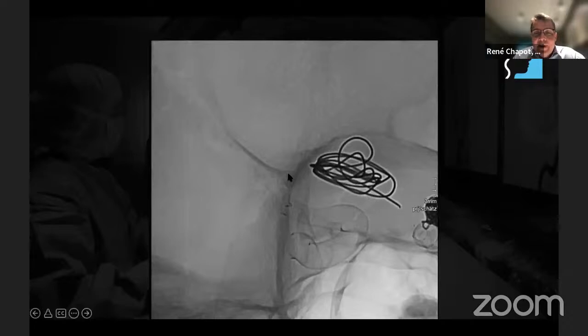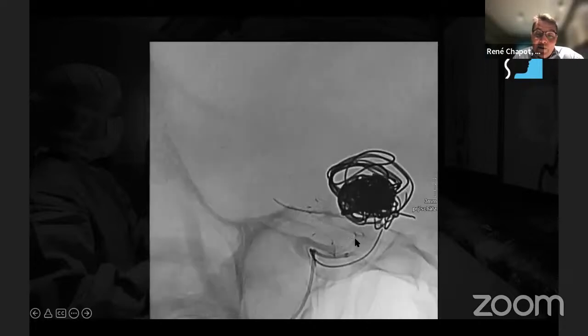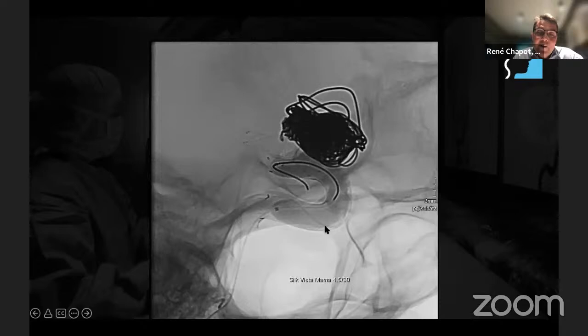It's not the end of the game just because you add a second layer. Indeed, what we need to do is to make this layer completely occluded. We need a kind of covered stent, but there are no covered stents that do this. So if there are none, we create a covered stent ourselves, which means we found a way here to go through. There are some small catheters that enable us to go through, but in addition, after coiling this, we left the catheter in contact with the first flow diverter, and placed a second flow diverter that we deliver here. So between both flow diverters, we sandwiched a microcatheter, which is in place, and then added a balloon.